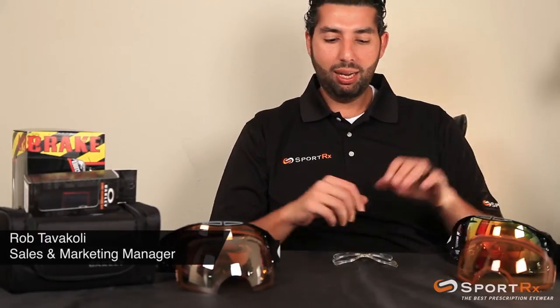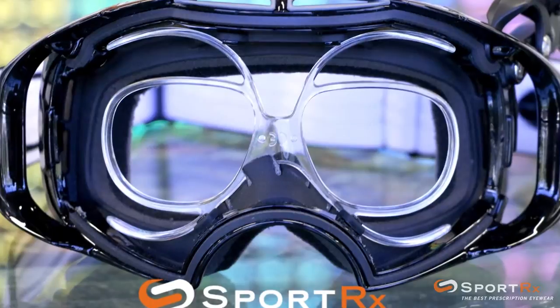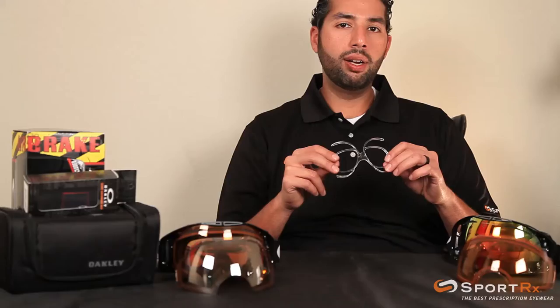Hey, this is Rob at SportRx and today we're going to talk about the prescription insert — how to get it in and out of the Oakley Airbrake. This is not exclusive just to the Airbrake; the idea is very similar to a lot of the way our inserts work, but here are the specifics on how to do it.